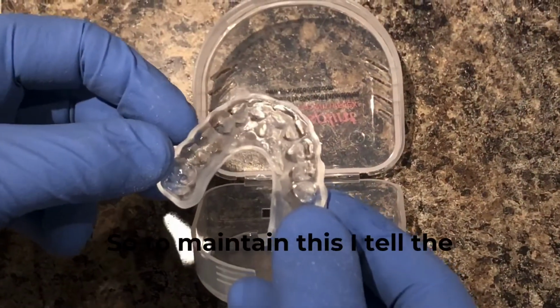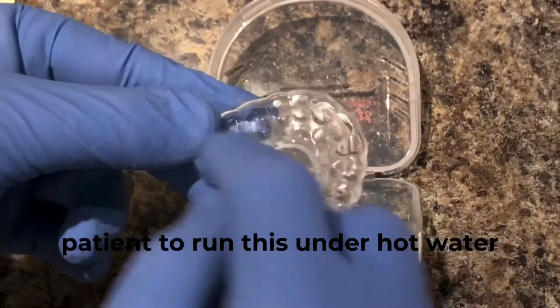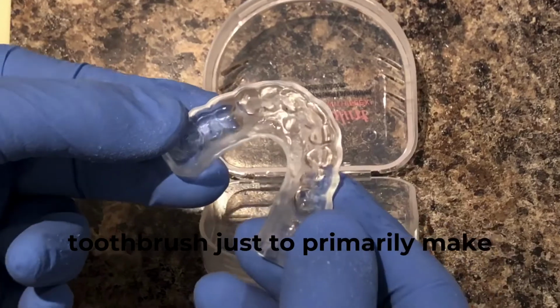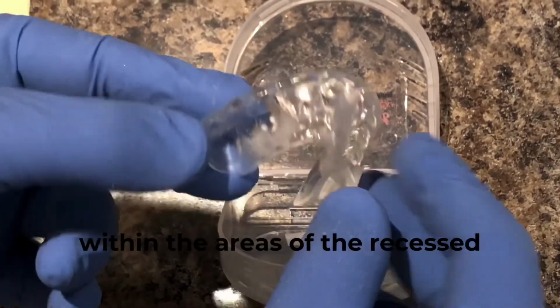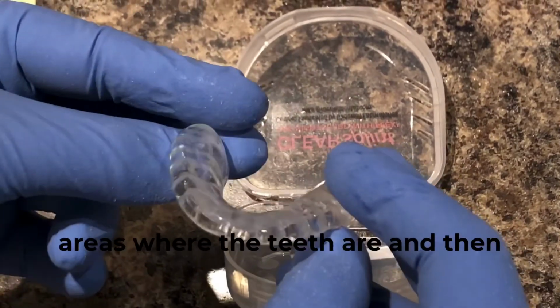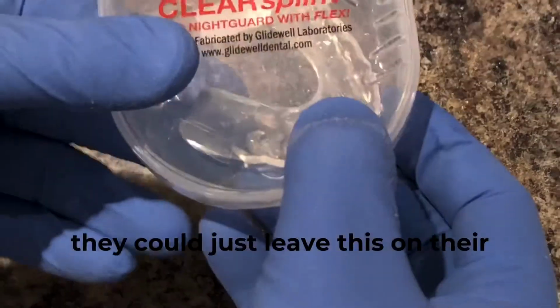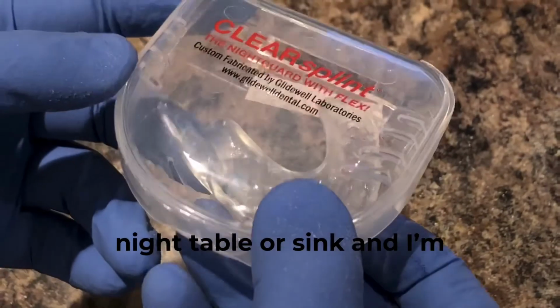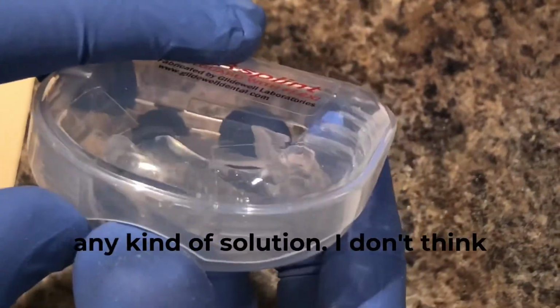To maintain this, I tell the patient to run this under hot water and brush this appliance with their toothbrush, primarily to make sure that there's no food or debris within the recessed areas where the teeth are. And if it's not in their mouth, it should stay within the case, and they could just leave this on their night table or sink. I'm not an advocate of soaking this in any kind of solution. I don't think you need to do that.